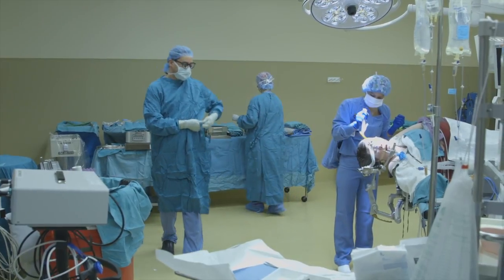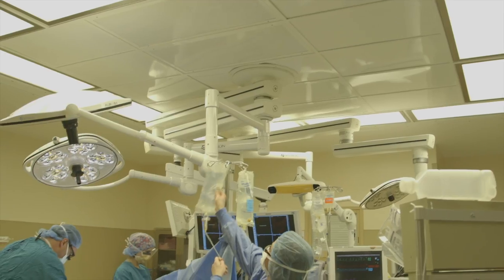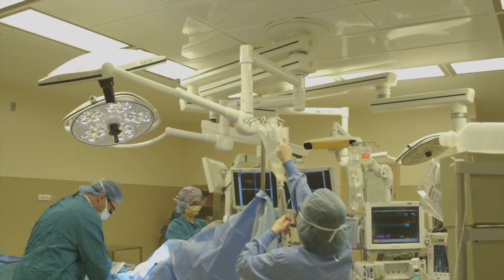The purpose of today's surgery was to get a better understanding of where we think the patient's seizures are coming from.